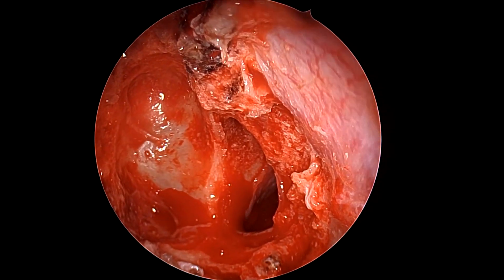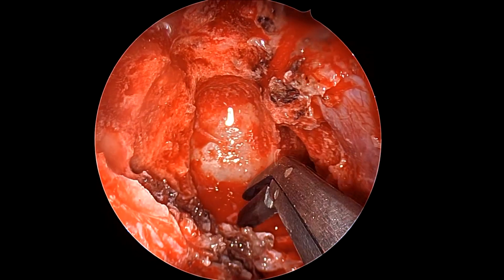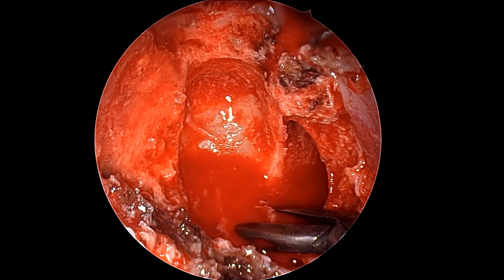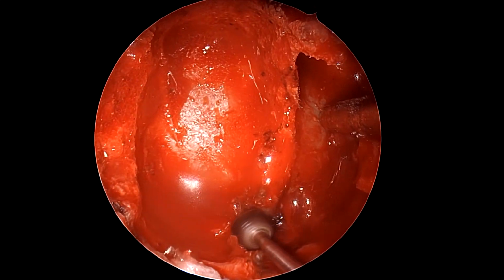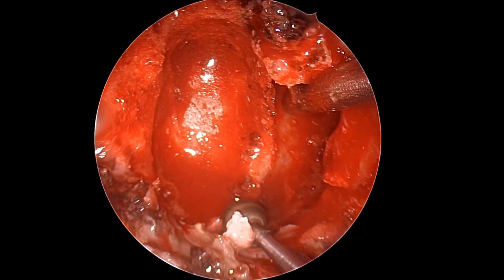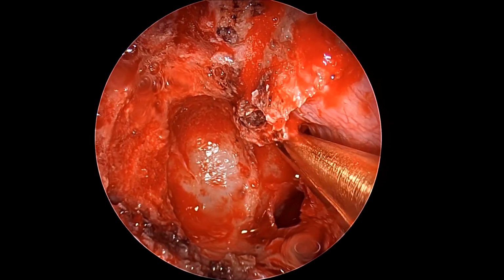You can see that now we can see how the bulge is sort of oblique, more on the right side as compared to the left side, and we're removing the sinus mucosa completely and pulling it off. Now we have switched to a diamond burr once we are going close to the sella. A diamond burr makes our surgery slightly longer, but also makes it safer. In case of an accident slip on the burr, we do not risk injuring any critical structure.